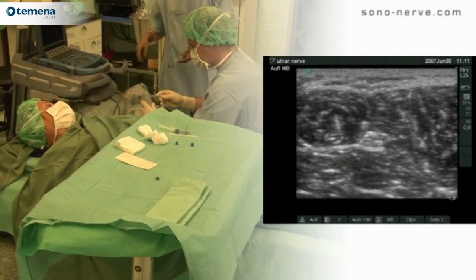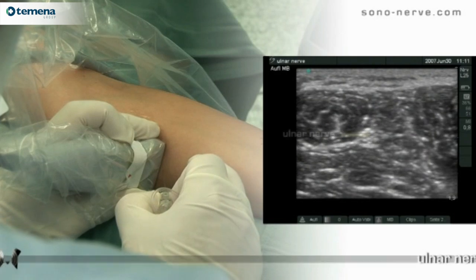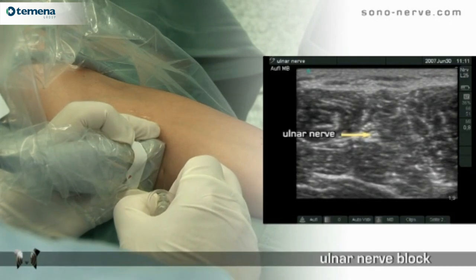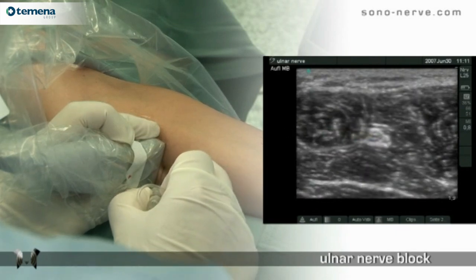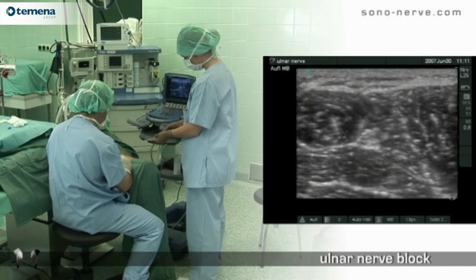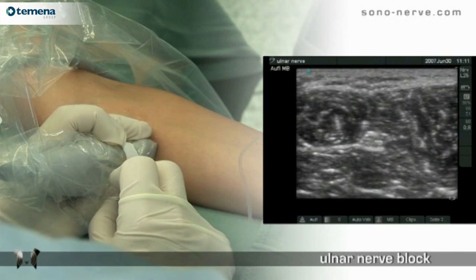For this block we use a 25 millimeter linear probe at high frequency 13 megahertz. This is an out-of-plane technique. The needle is passed roughly in the plane between the flexor carpi ulnaris muscle and the flexor digitorum superficialis muscle.